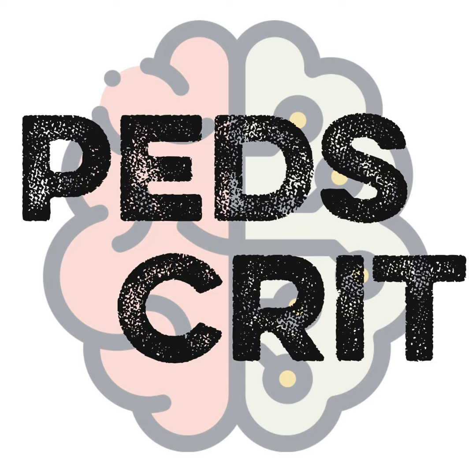It's weird to try to place a PEEP on the inspiratory limb and try to identify kind of a lower inflection point when the lower inflection point is an inspiratory part of the curve, whereas PEEP is end expiratory pressure. So it's conceptually weird, and it's slow, but it is safe. So in somebody who's hemodynamically bad or who I don't think is particularly recruitable, then that is the strategy I'll use.